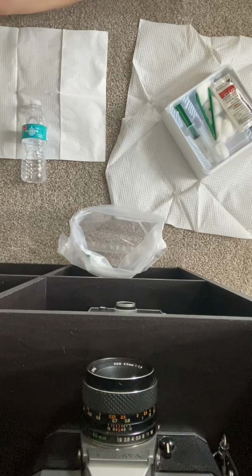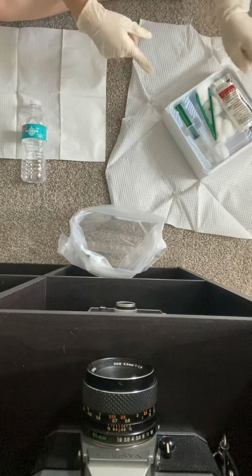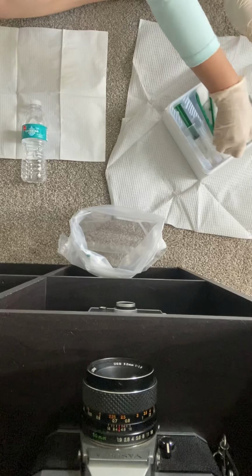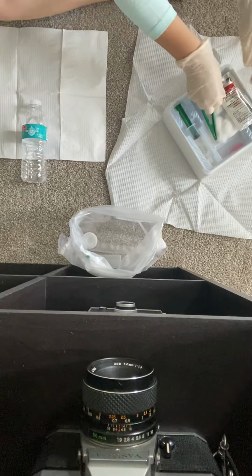So next thing I'm going to do is pour my iodine in, get my lube ready, and then attach my syringe to my catheter. I'm going to go ahead and do that right now. And then I don't need this. If you did need a specimen, you could use that, but I don't need one.